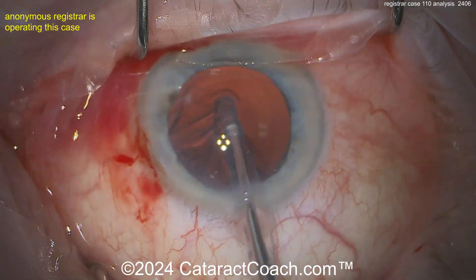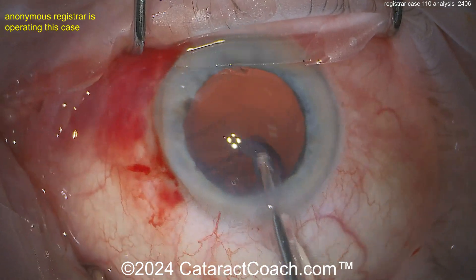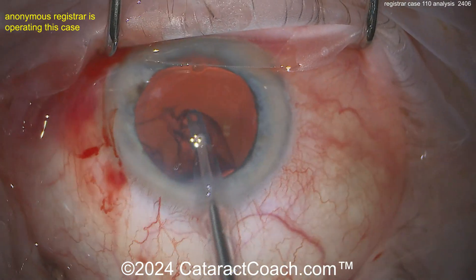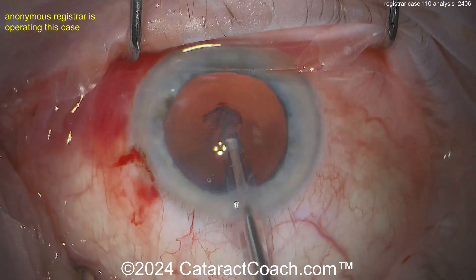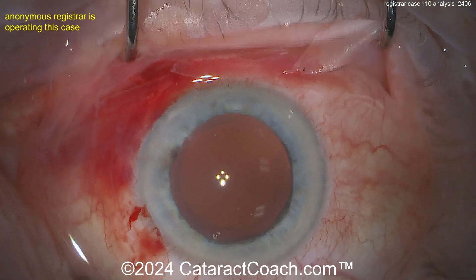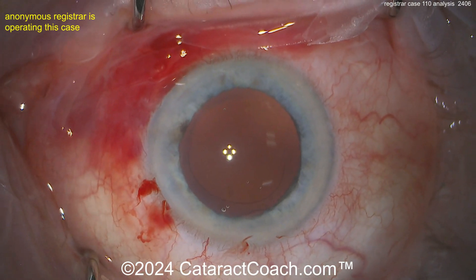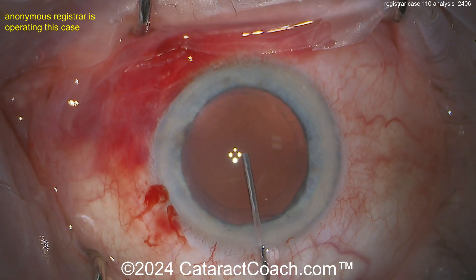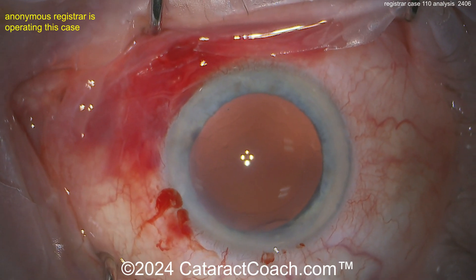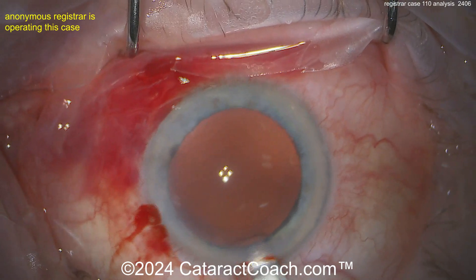I know that's what your professor told you, and that's okay — it's reasonable and it does help for the reasons we discussed. But I'd look to get your settings a little more fine-tuned. There's a 10-part series called Phaco Fundamentals on CataractCoach.com that will teach you all the phaco settings and how to choose them to address exactly what you're seeing here.